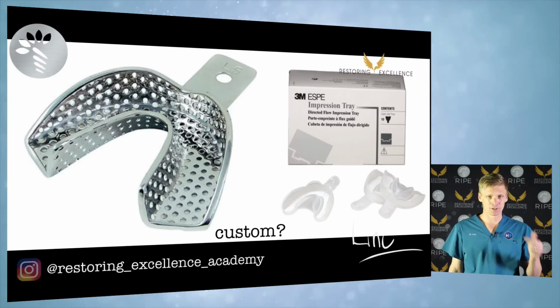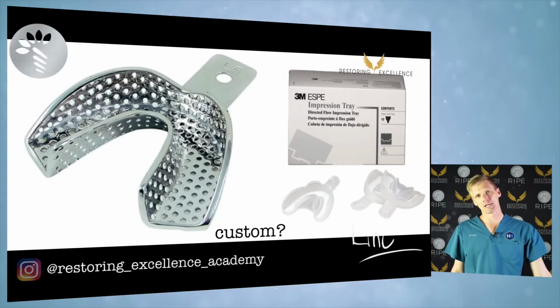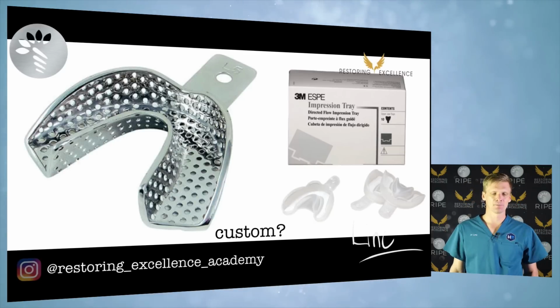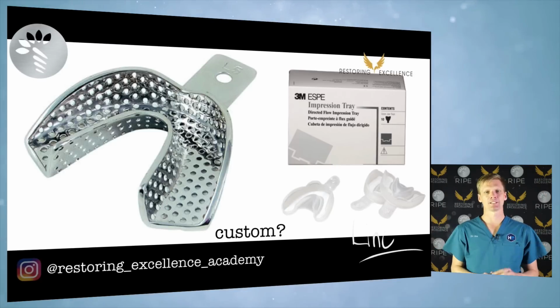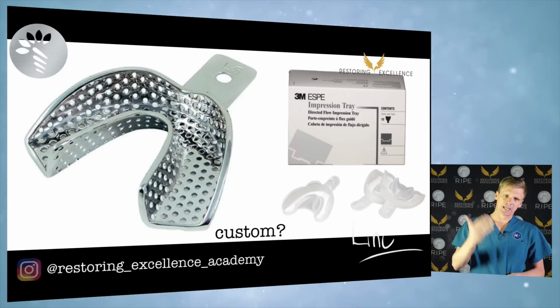Plastic trays are hard to get out too. You mostly get impressions stuck early in your career because you're too gentle. Later on in your career, you hardly ever get them stuck because you just go, okay, these teeth, something's coming out. So that's just my advice on trays.